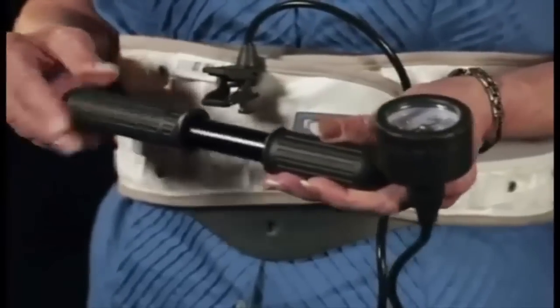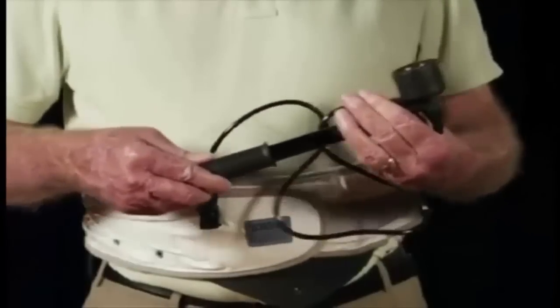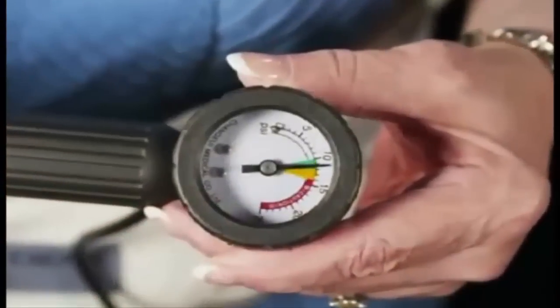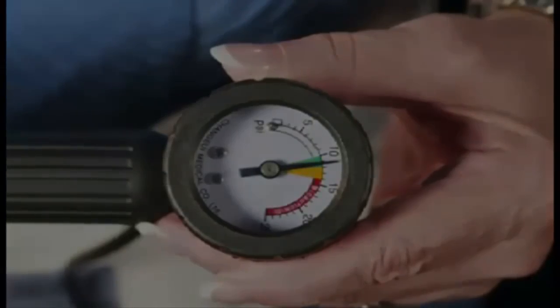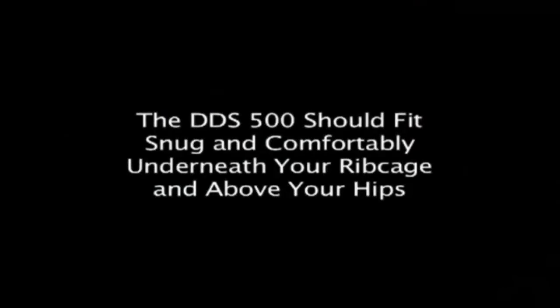Step 5. Inflate the Traction Belt using the hand air pump with easy short strokes until the gauge on the hand air pump indicator reaches the green orange area. Do not allow the gauge to go to the red area. You may adjust the Back Traction Belt according to your body type by adjusting it higher or lower on your waist. You are now ready to enjoy the comfort and stability of your DDS Back Traction Belt.